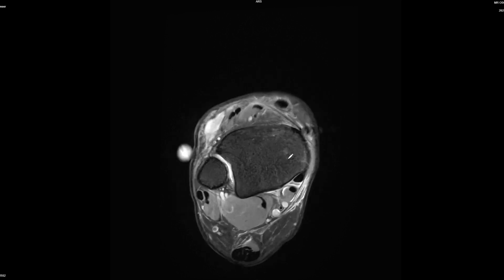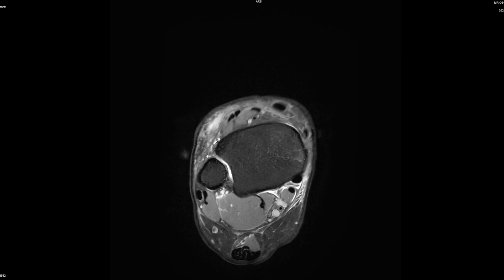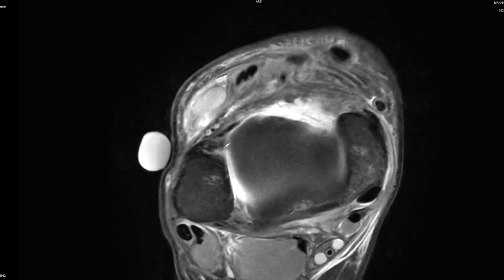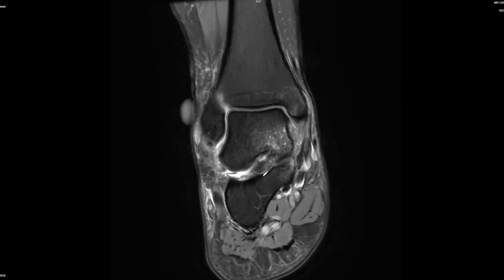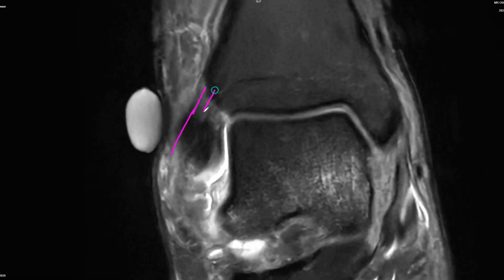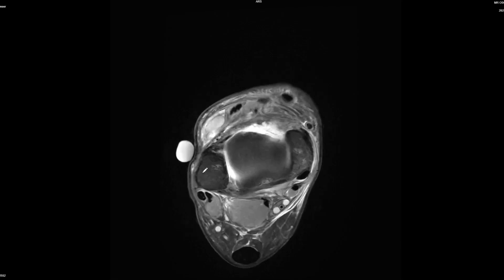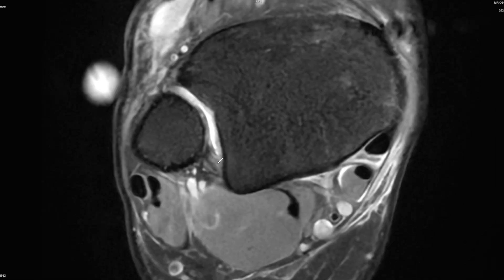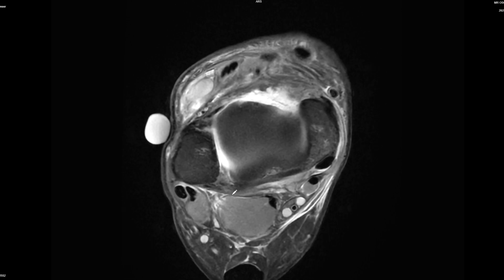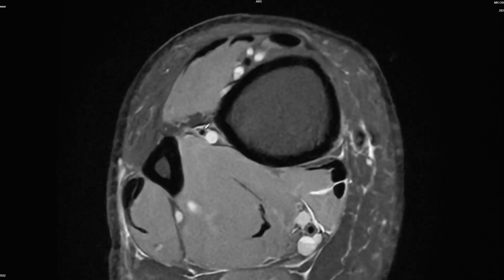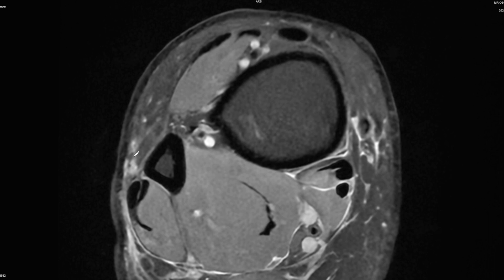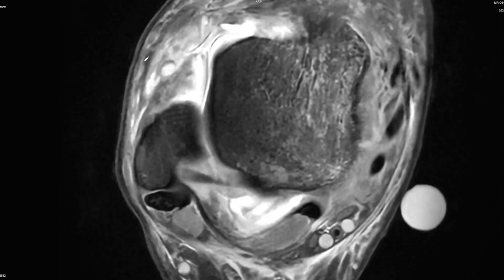Next is the assessment of the syndesmosis. Looking closely we can see the striations and Bassett's ligament, all continuous and straight down. On the coronal we also see nice striations, so the anterior syndesmosis is intact. The posterior syndesmosis is also not consistent with any major injury. There is no edema in the interosseous region or interosseous membrane - no evidence of a high ankle sprain.